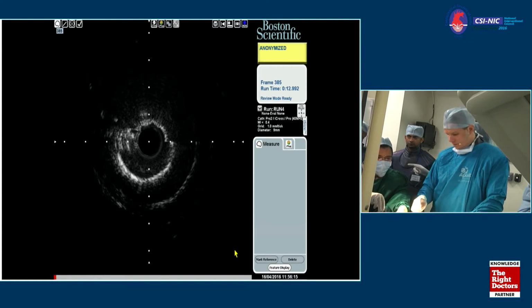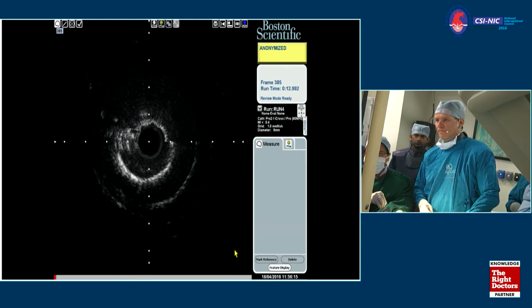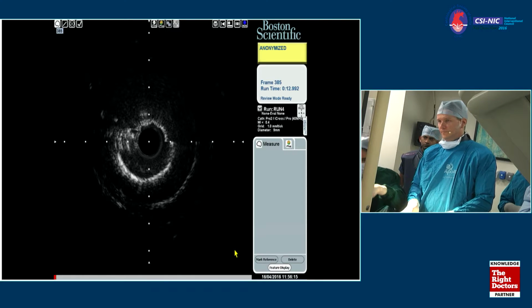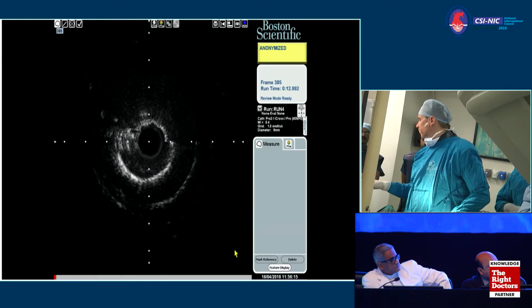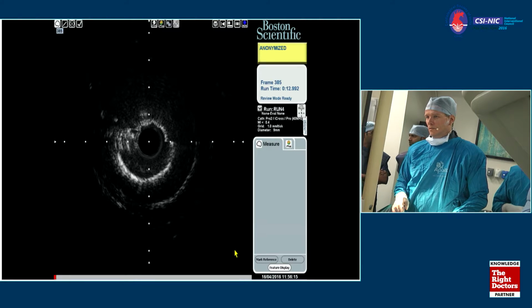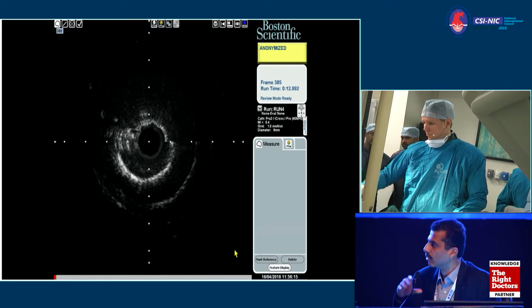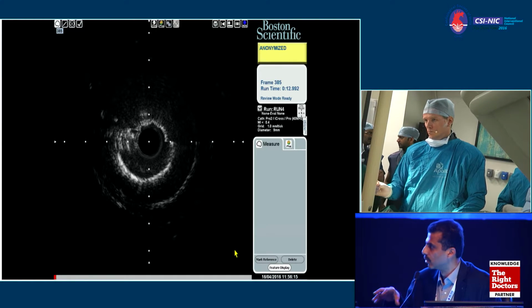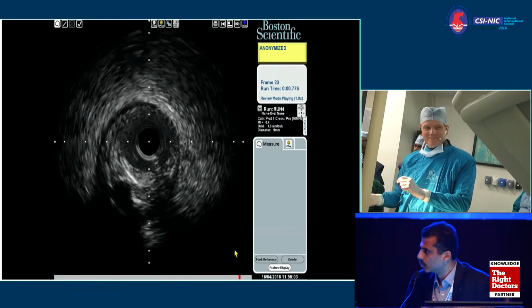Very nice. What do you think, Dr. Mehta? How was the case? You could conclude the session. I think we just have a quick comment. Yeah, okay. Go ahead. Retrospectively, what I would like to say in this case is, if you had done an IVUS pre-procedure, we would have clearly known that there's a lot of ostial disease, and we would have pre-dilated the distal left main adequately, because he had a lot of difficulty in post-dilating after the stent implantation. And then definitely it would have been a 2-stent strategy.